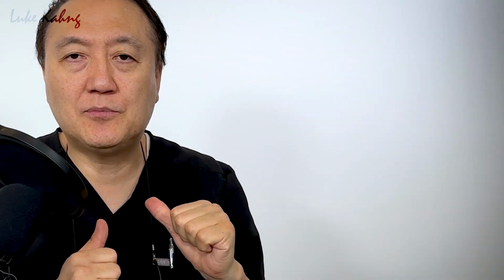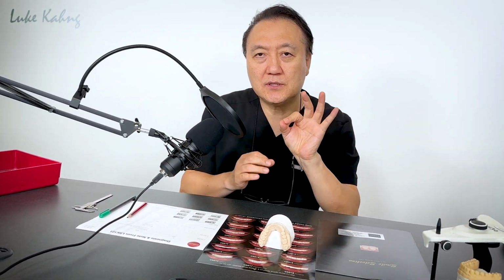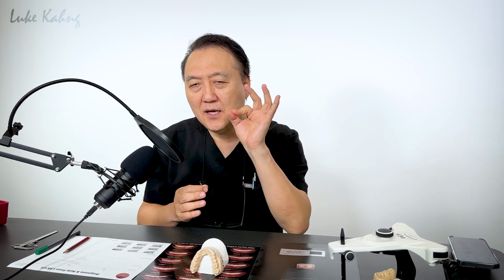My job is to make the good material selections compared to the preparation color, and then the outside is thin, which is 3/10 or 4/10, 5/10 millimeter, even 1/10 or 2/10. I have to make the nice tooth form, adapt with the tissue, and then create the color. That's my goal, right? So a diagnostic wax-up is pretty much essential.